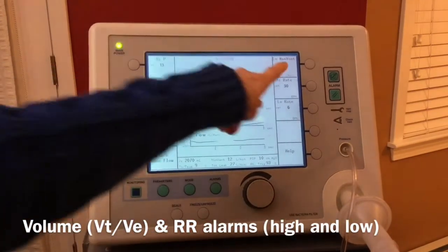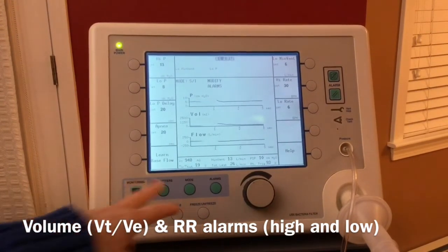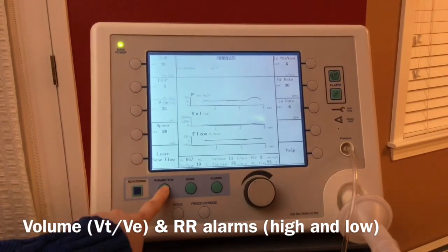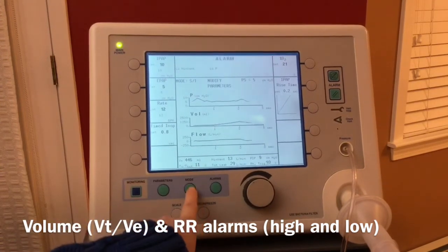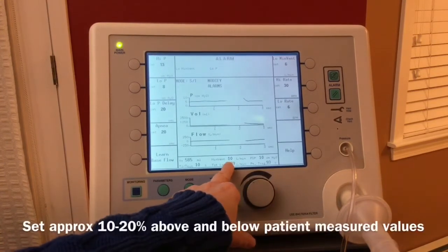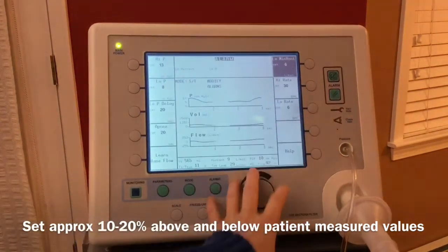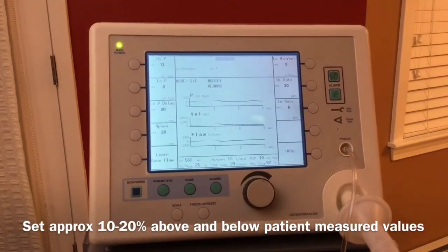When I'm setting minute ventilation alarms, I'm going to look and see what my patient's actually doing. This patient's breathing anywhere from 600 to 900. So for low minute ventilation with a minimum rate of, what do we set? We can go back to parameters and see here. We set a rate of 12. So if we multiply 12 by 700, that'll give us a low minute ventilation for where the patient currently is. Then we can also look at the minute ventilation on the display screen. If this person is doing anywhere from 10 to 13 liters, I would want to set my low minute ventilation closer to the 10 mark, so maybe about 8, because we see a 9 here. They slow down, they speed up. So a couple liters above and below would be reasonable.